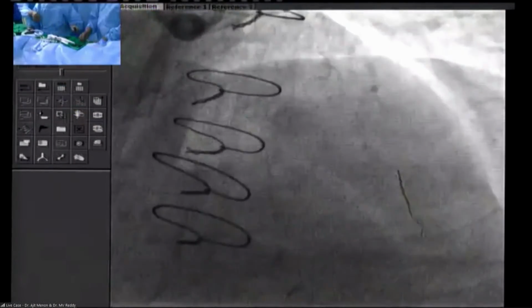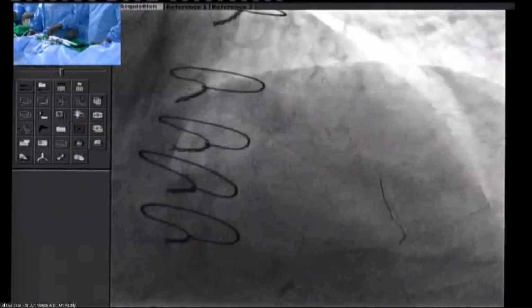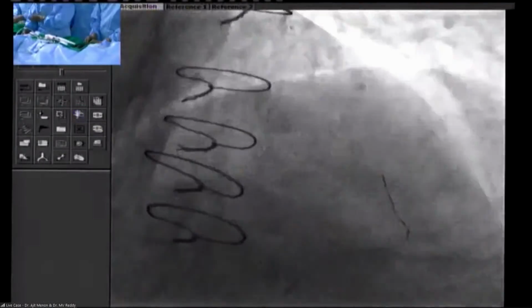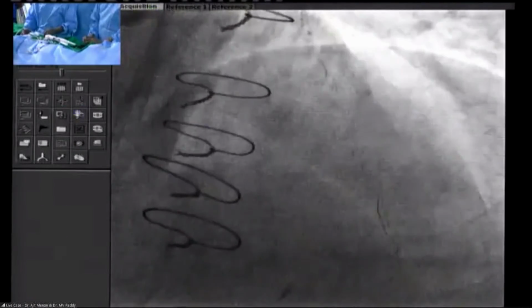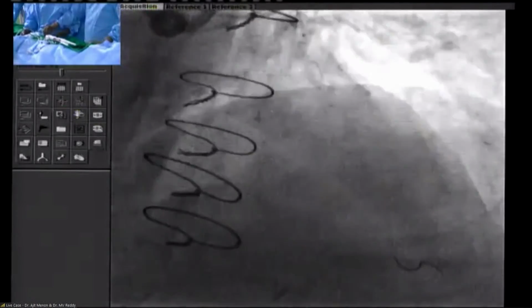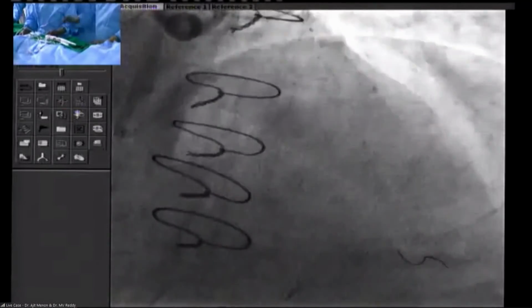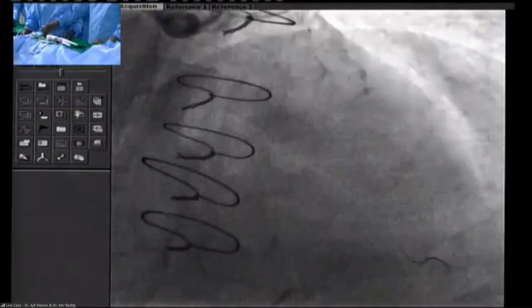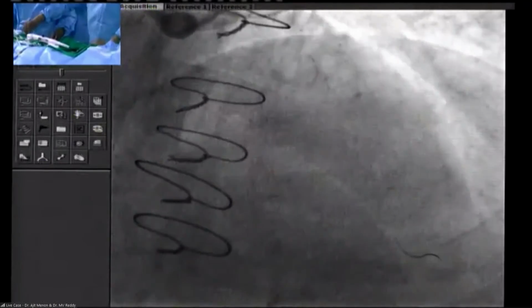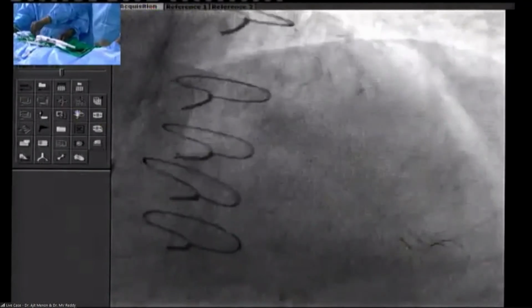Take this wire out. But I think, when you're looking at these cases in your own hospital and maybe don't have the same backup there is here, if you've just avoided a catastrophic event where the patient is having CPR, et cetera, and you've already done an intervention, then it's not wrong to stop, regroup, and fight this another day. Obviously, when you're doing transmissions and multiple people are involved, it's a little different, but probably shouldn't be. And so I think for many people at this point, resolution and watching would be the right move.